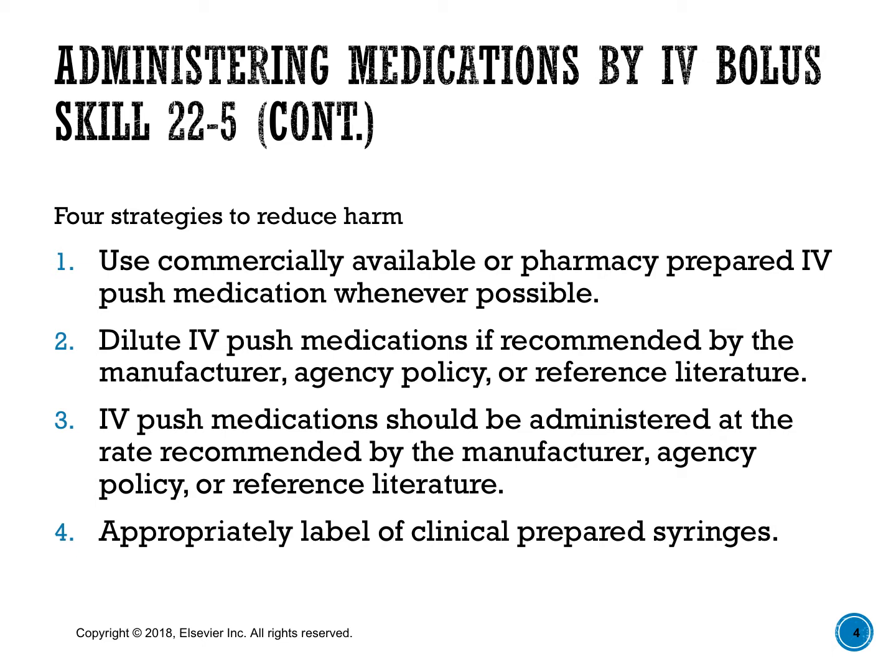I remember when it was one of the first jobs that I had. I worked on a unit where we had a lot of surgical patients. And back then, it was before Zofran, and we used to give an antiemetic called Phenergan, and it was very irritating to the veins. It would burn if you didn't dilute it and push it slowly. So very important that when you look up your medications, you find out if it has to be diluted. Some have to be and some don't have to be.